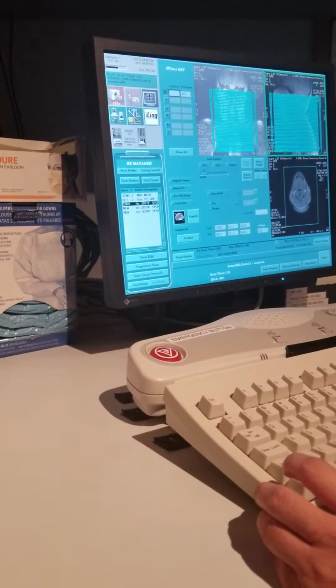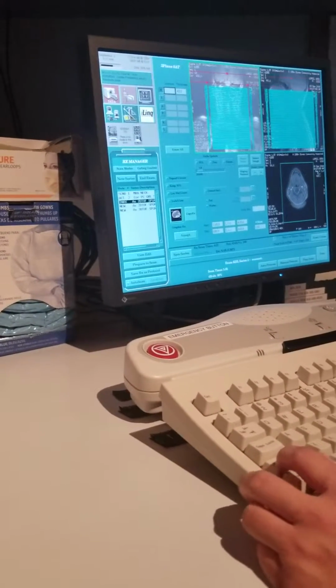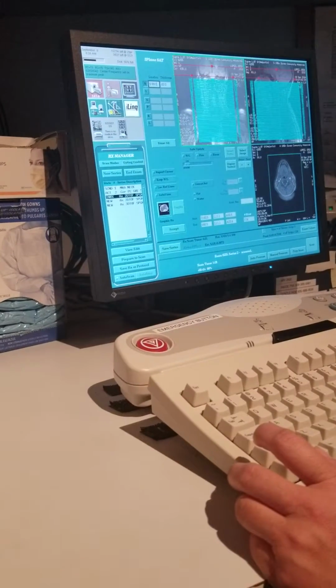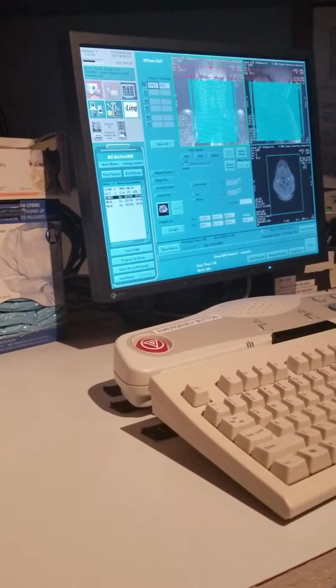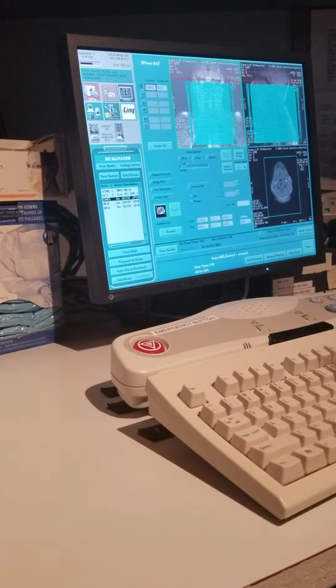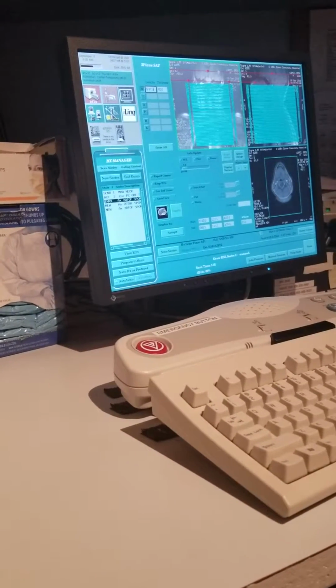I think there was a little S, so it was already placed there, technically. Because a capital S would be outside the field of view, right? Hey, you can bring it closer. Oh, okay. I know, Mo got really mad at us. It was too close. Too close.